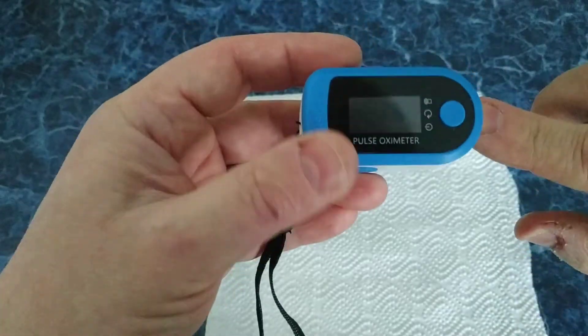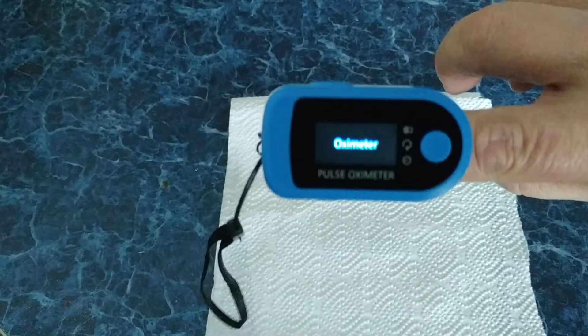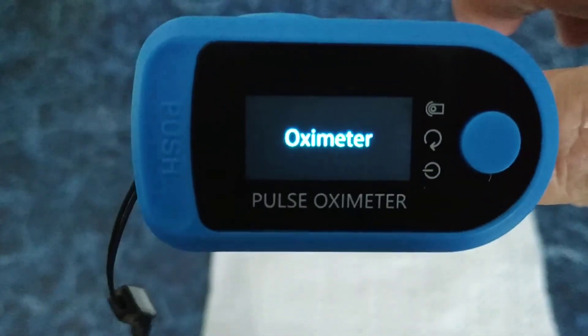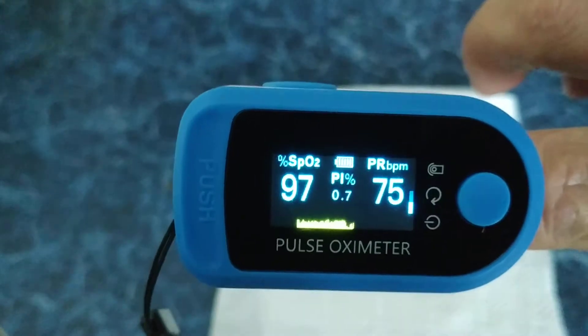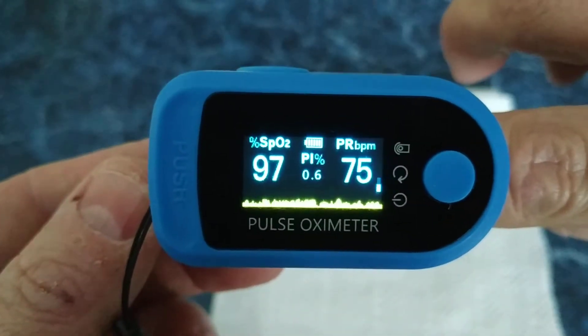Let's measure it on my finger. Press the button. You see the oximeter. And how much oxygen level do I have? It's 97. Okay.